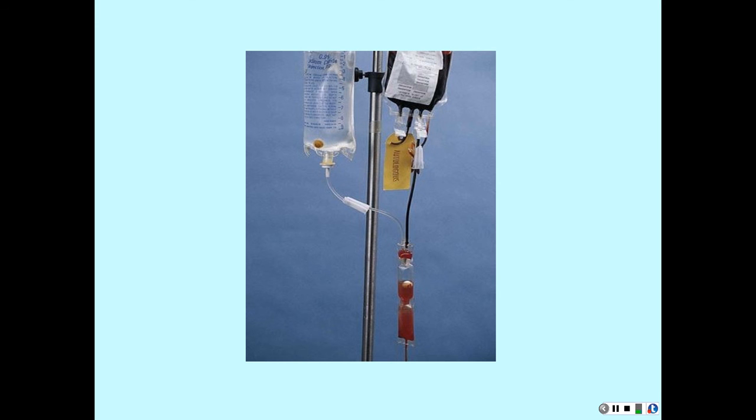Yes, you're priming it with the saline, flushing your tube, getting the air out. Yeah, because you've got blood all up in this connection here and all the way down to your patient. So what you do is cut this bag off. Cut this one off, open this one, and then this one will infuse and wash the blood on out, because you may be hanging 2 units.